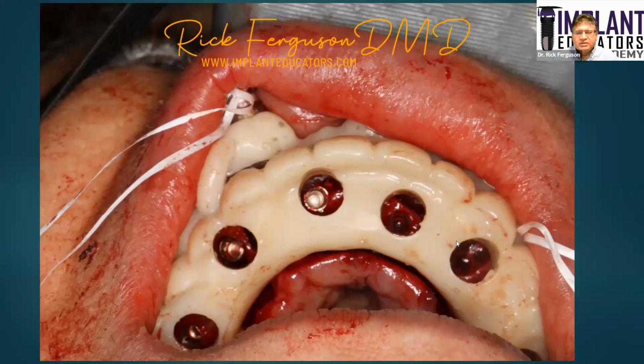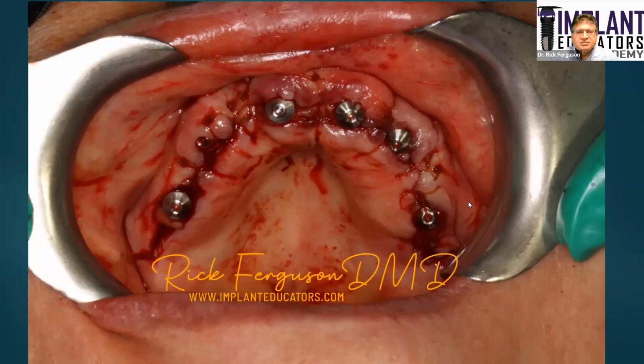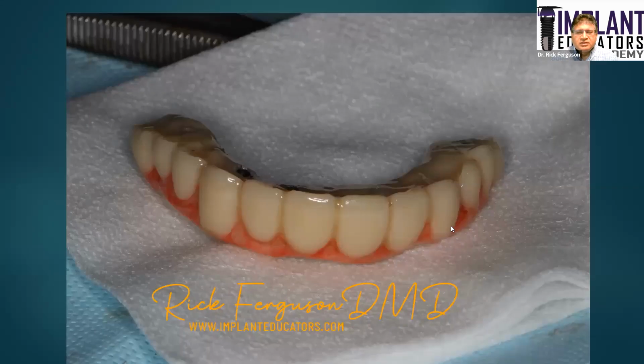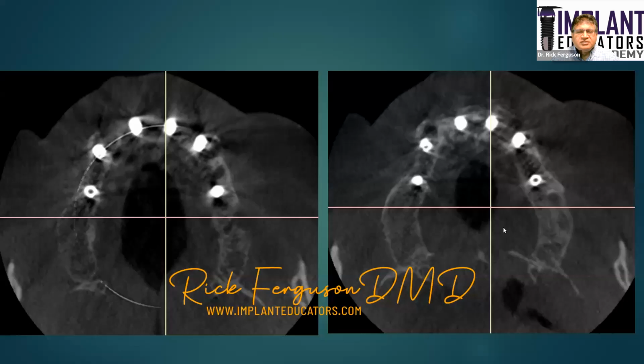And if you look through now, we can place the temporary hybrid, which also fits onto the bone reduction guide. You can see the implants through the holes that we had made prior. And now we put in our multi-unit abutments and did a pickup. And while the pickup was being finished by my assistant, this is what it looked like. We then did the closure. So the closure is done, like on the previous case. And what you see in here now is the temporary hybrid being fixated.